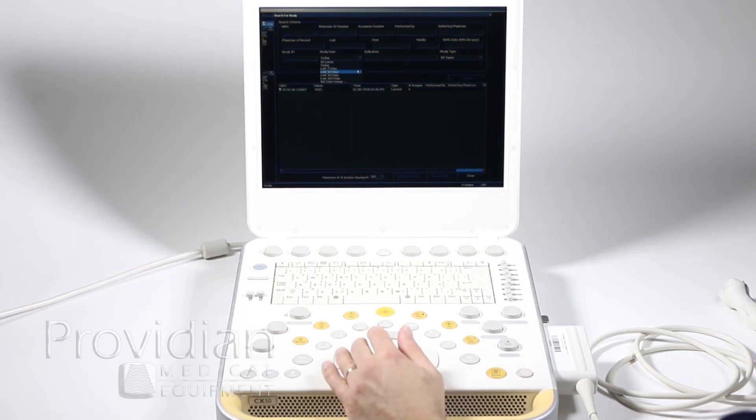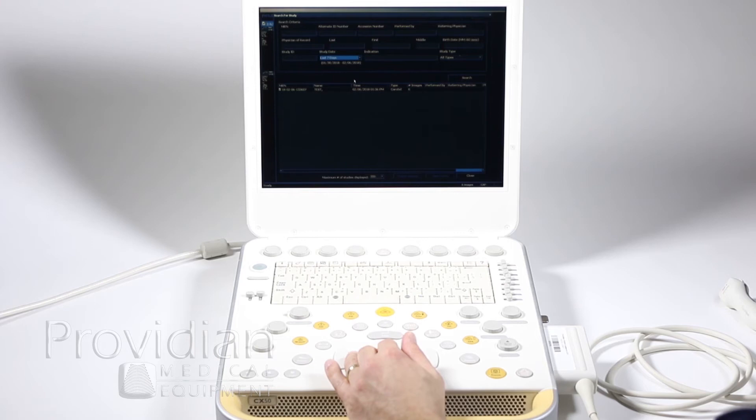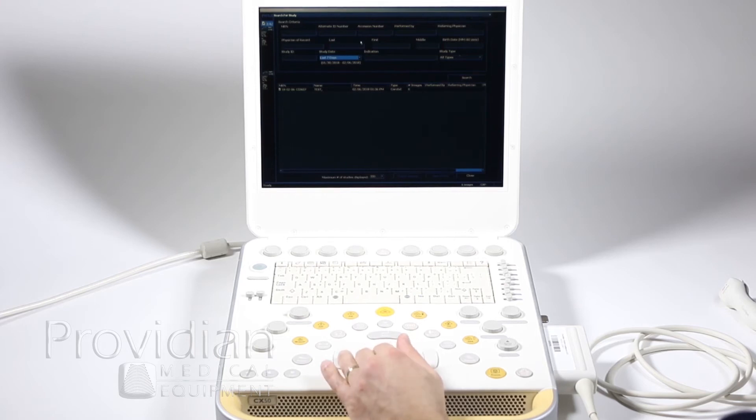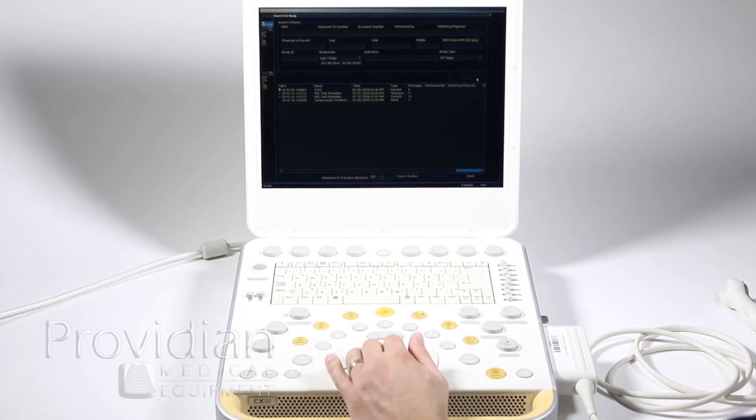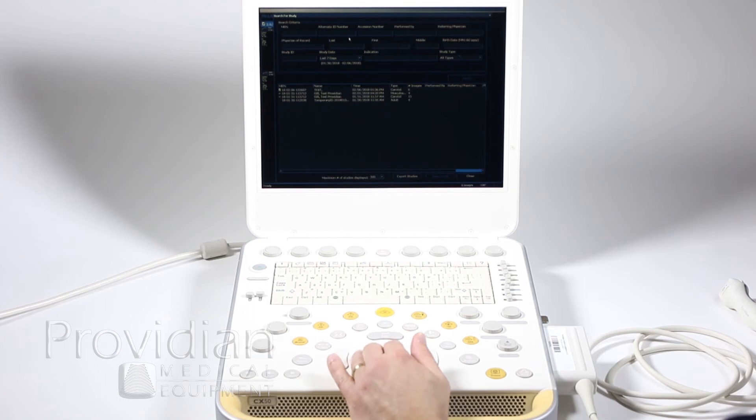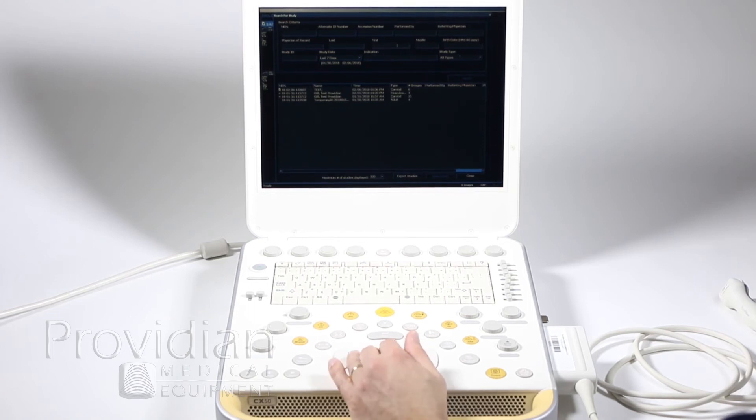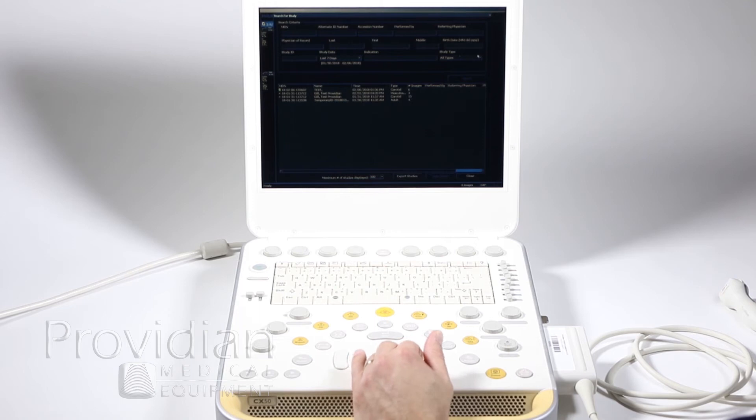If I want to select a separate one, I can go to the last seven days and pull up a previous—I'm going to choose that, click Search. I can also search by MRN number, last name of the patient, and various types of things such as the study types.